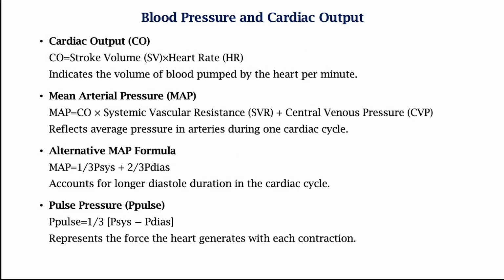Recall how you can find the central venous pressure? Long time ago, not too long ago actually, in one of the previous videos we saw, where would you measure the central venous pressure? What is the reference point? In our first class on pressure measurement, I mentioned this. If you don't recall, it is time for you to stop this video and go back to that video and find out what it is.